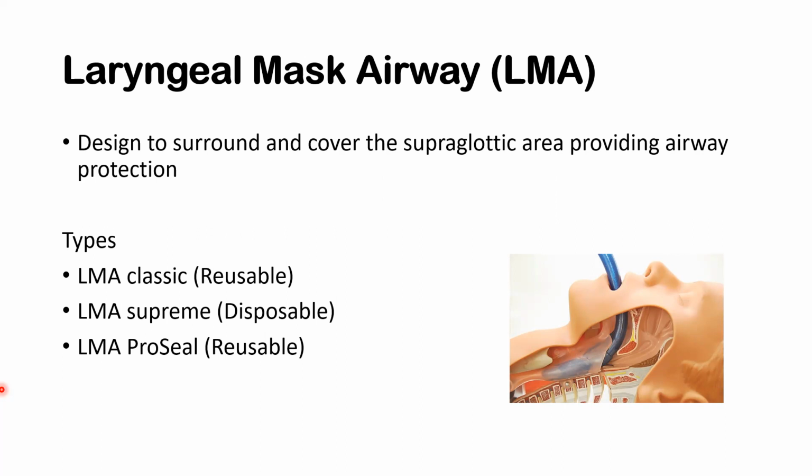Sebenarnya before you bagi you punya muscle relaxant, you should always test whether you can bag the patient. Walaupun you did not bag the patient before, you tak rasa pun perlu because patient can saturate well. The patient is doing the pre-ox well on their own. They have got a good effort. So you dapat 100% pre-ox. Tapi you should still test whether you can bag the patient because prerequisite to you giving the muscle blocking agent. Sebab bila you block the muscle, dia tak boleh breathe. In case of failure of intubation attempt, then you need to bag kan. So that's not the time that you want to test. You want to test before you give the relaxant.